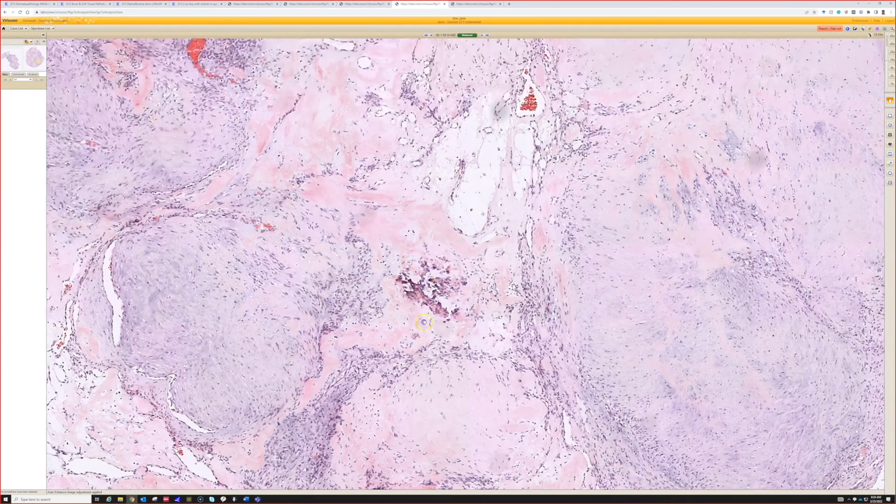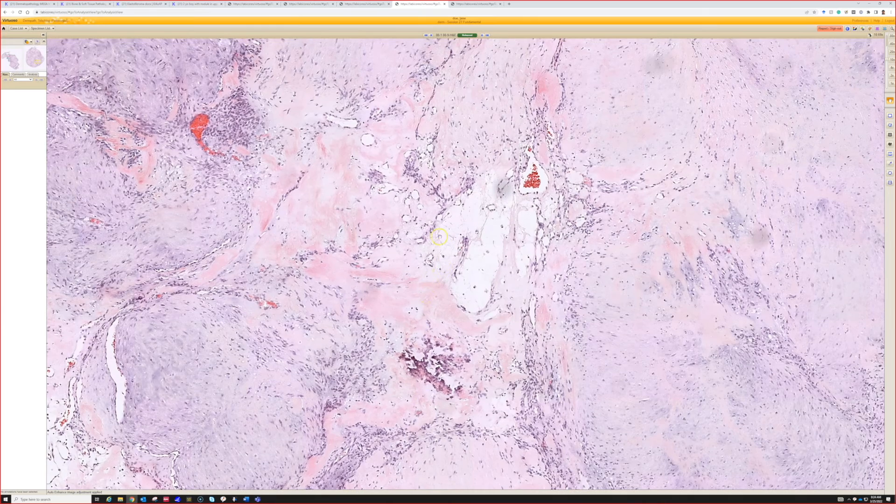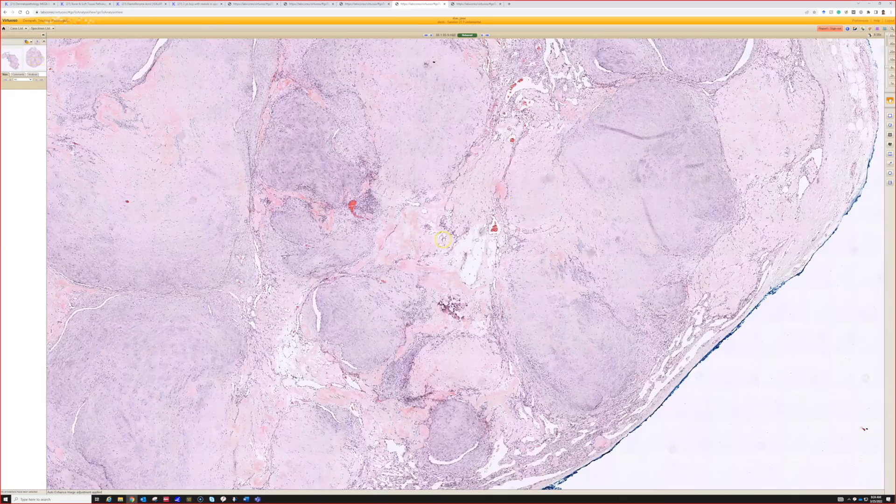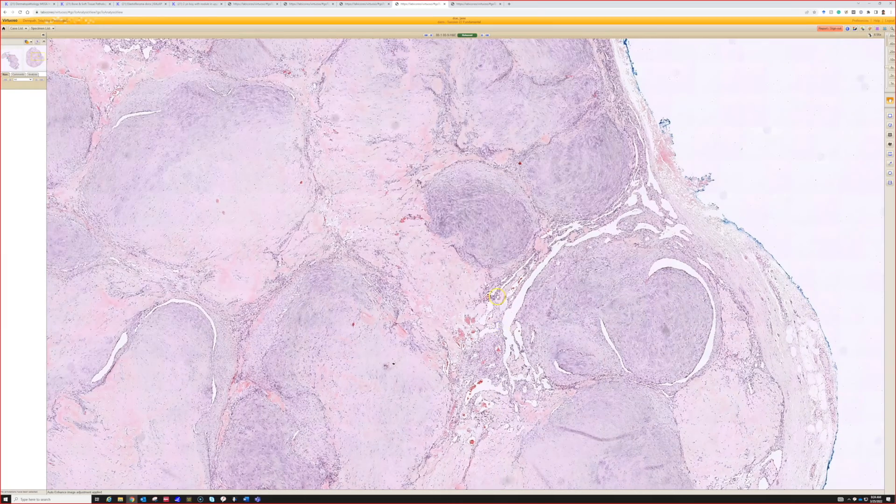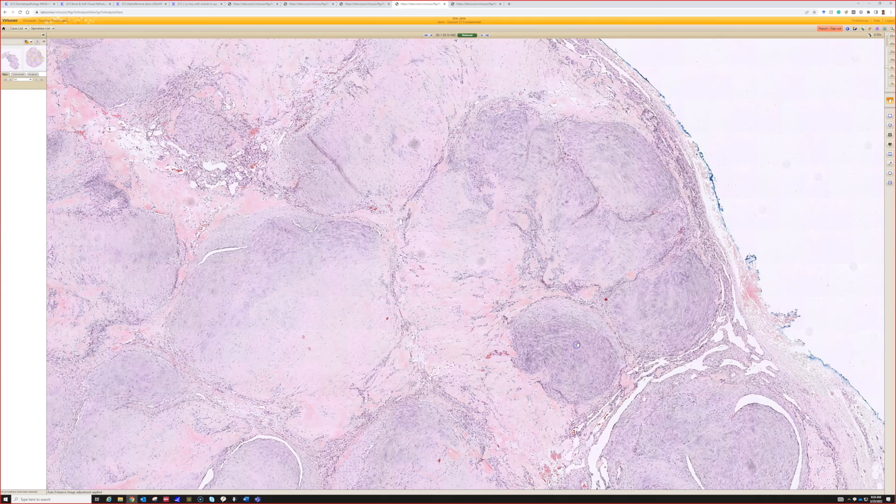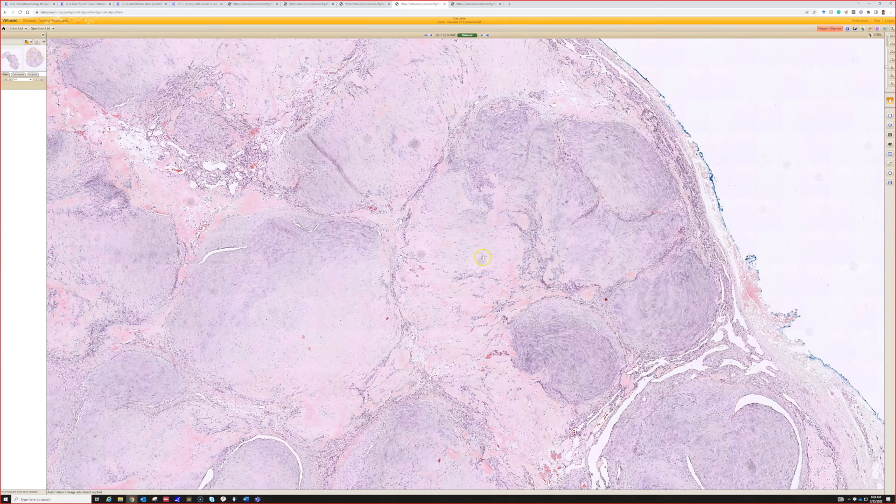Usually this is an H&E diagnosis to me. I feel like when I see one of these I don't do any stains. It's just classic - I don't know what else would look like this.